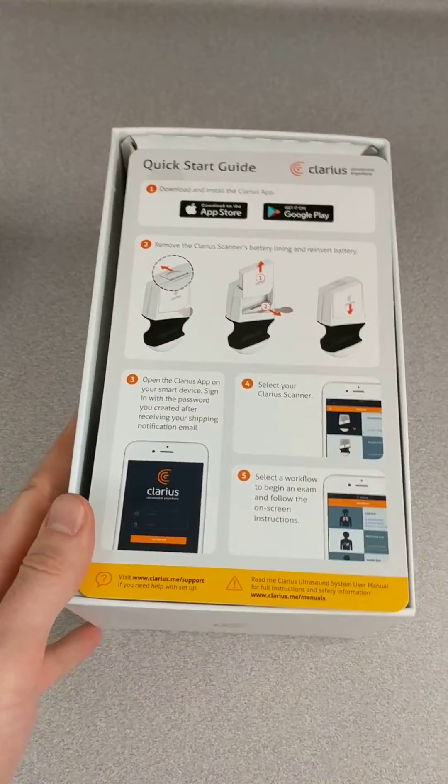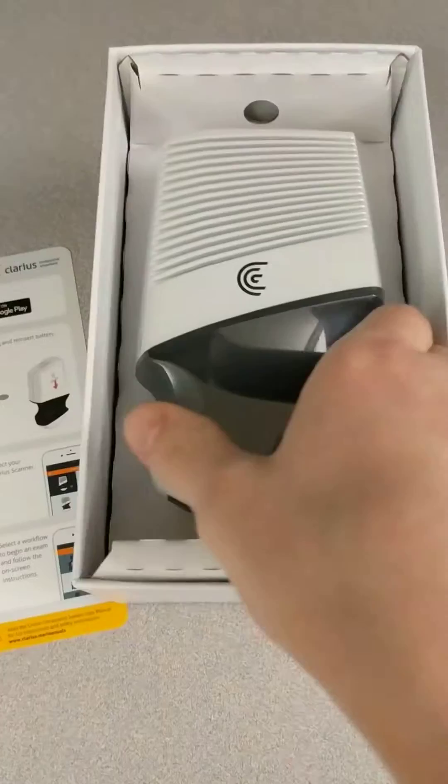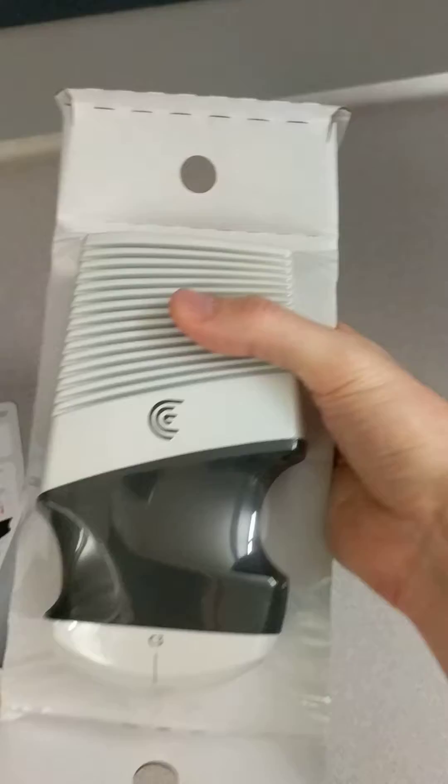And we have a quick start guide, so looking forward to getting started with it. When you open it up — here you go — just a handheld ultrasound machine. This is crazy.